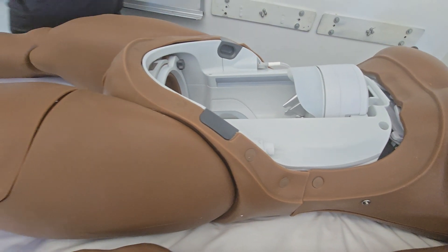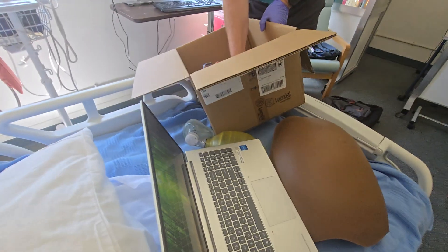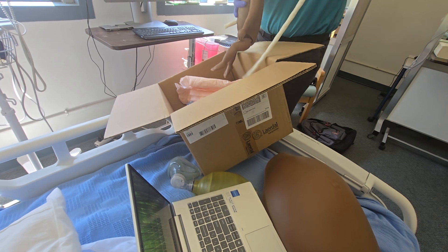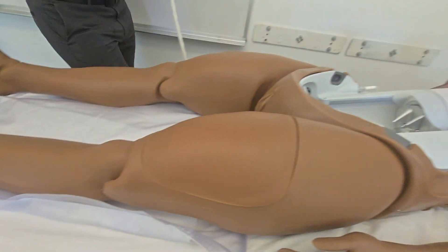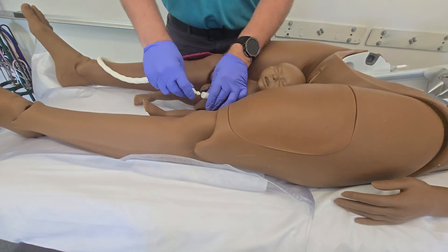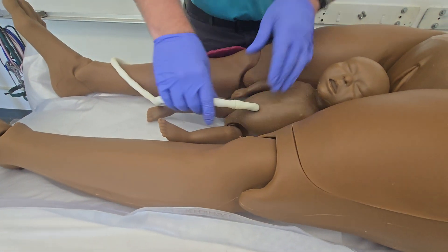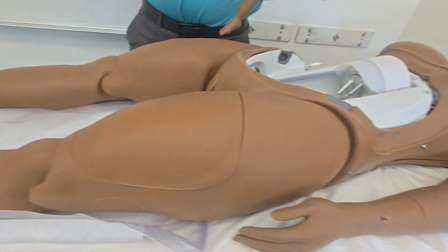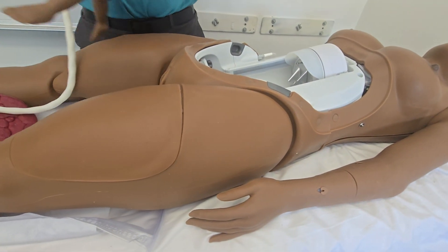The baby and the placenta are both going to have this umbilical cord. Additionally in the install you get five cuttable umbilical cords. Those cuttable umbilical cords can also be filled with fluid, so if you want to simulate the fluid in the umbilical cord secreting when someone eventually cuts it, you can do that.